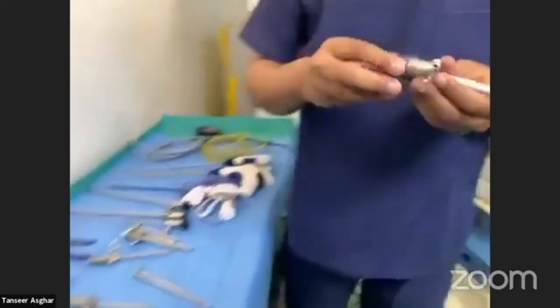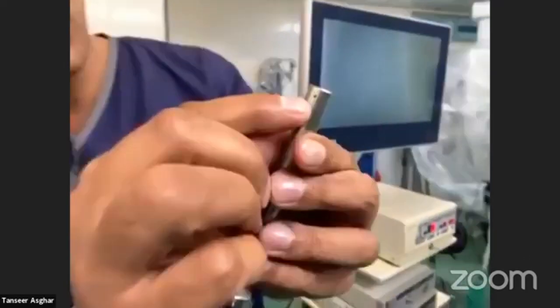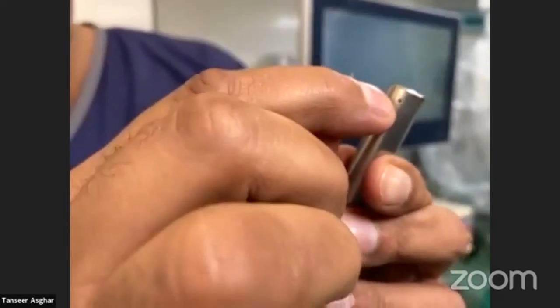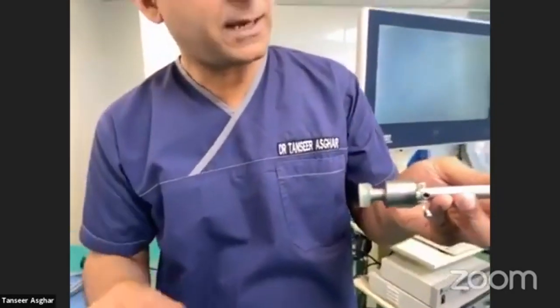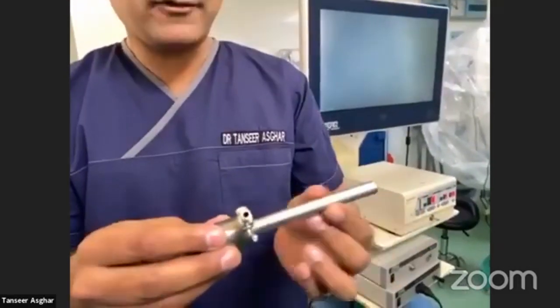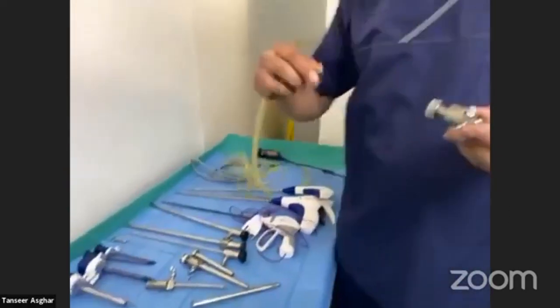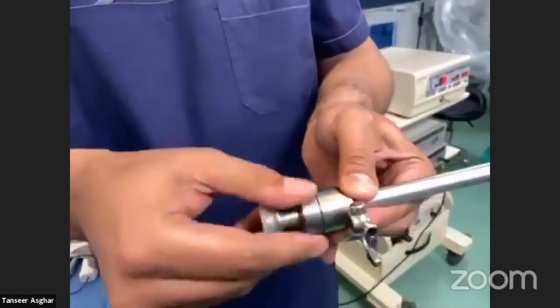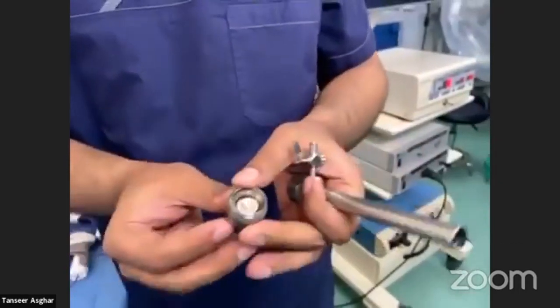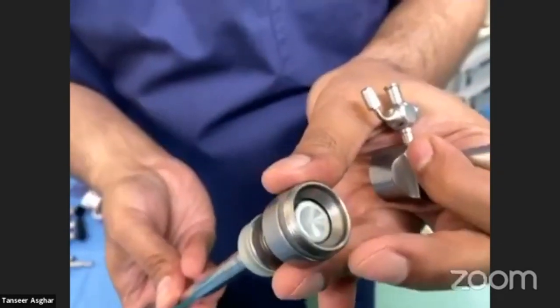Now coming on to the cannula. The cannula has different components and different companies present it in different ways. You can see small holes — the carbon dioxide gas used for insufflation goes in here. There is another hole over the trocar and you hear a hissing sound confirming you are inside the abdominal cavity. The cannula has a shaft and a wall where you can attach the gas pipe, and you can switch it on and off. If you open the cannula, you can see a safety valve which should be working well so that it doesn't leak during the procedure.